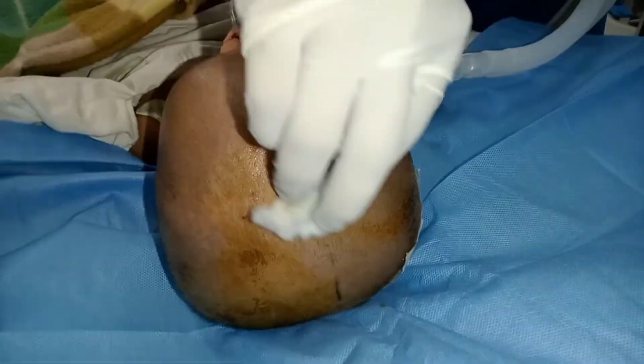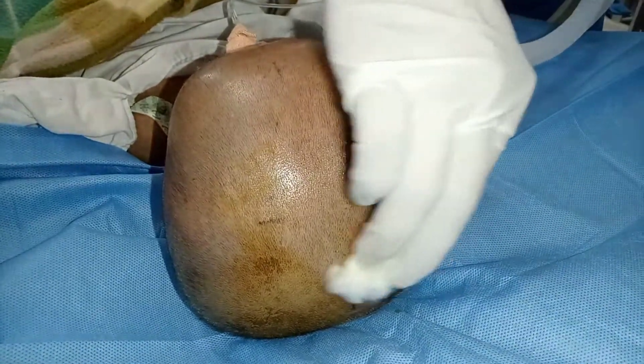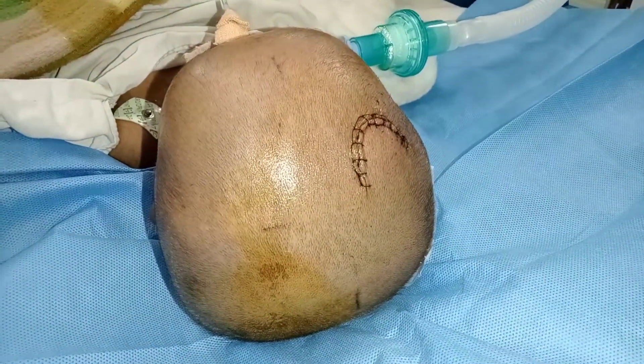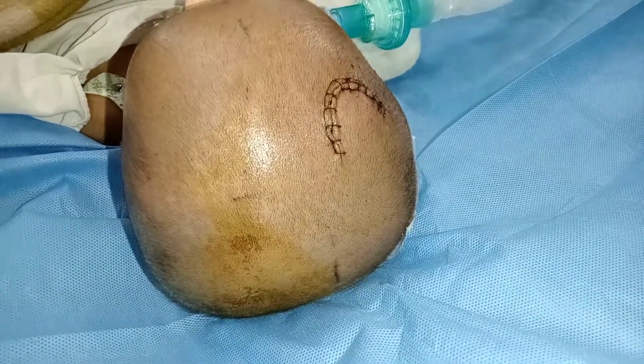Here is the third step, where we thoroughly clean the betadine with spirit. Now we wait a few seconds to dry up the area.